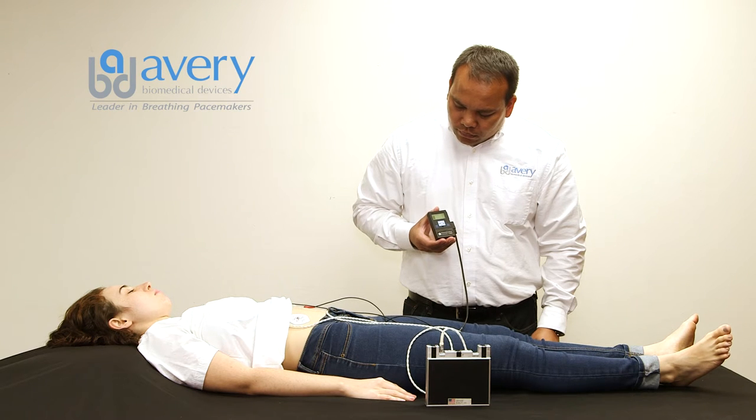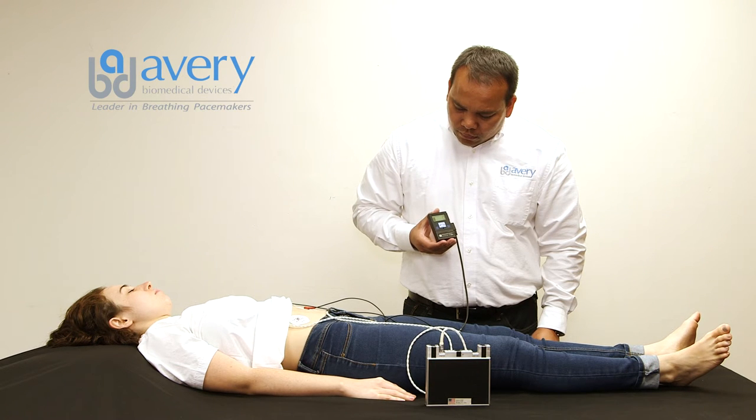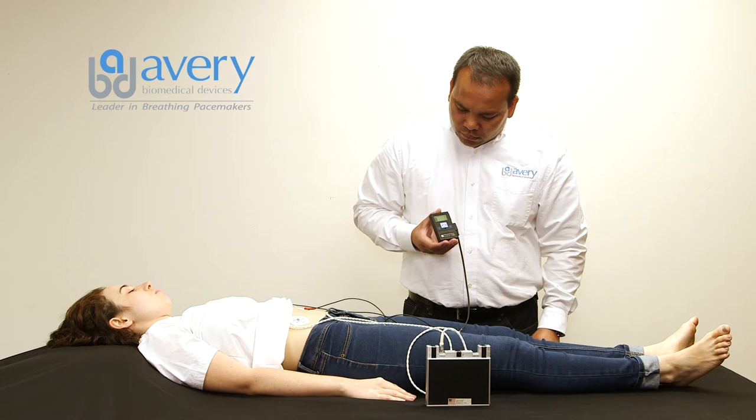During the recording process, the patient must remain still. If the sound changes tone, there is not a good connection to the patient. Re-check the skin electrodes and snap button connections. The recording takes 30 seconds. Once the recording ends, a warble beep will be heard.